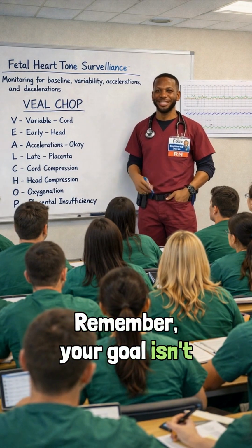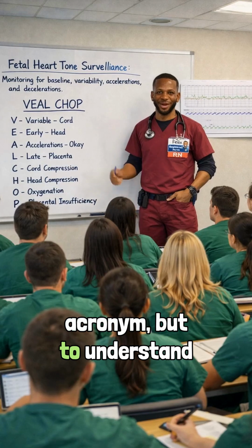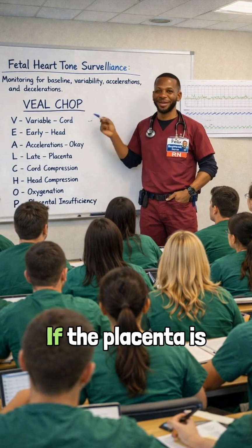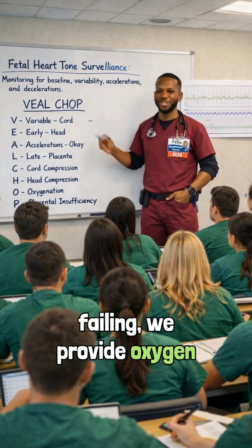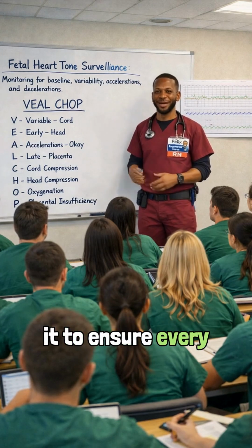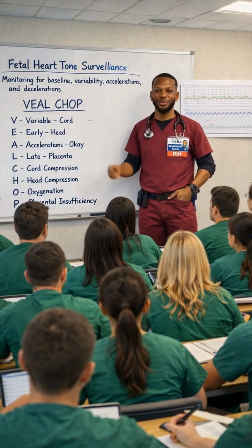In conclusion for the class, remember, your goal isn't just to memorize the acronym, but to understand the why behind it. If the cord is compressed, we move the mom. If the placenta is failing, we provide oxygen and fluids. You are the interpreter of that monitor strip. Use it to ensure every baby has a safe path to their first breath.